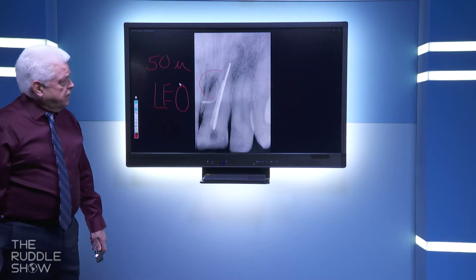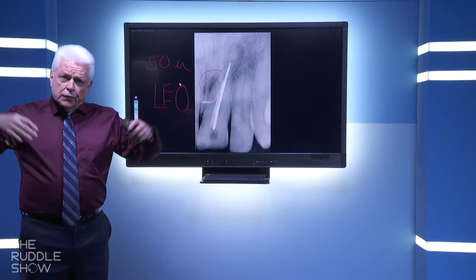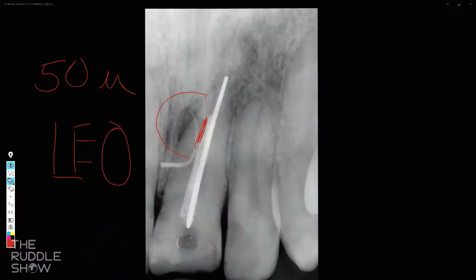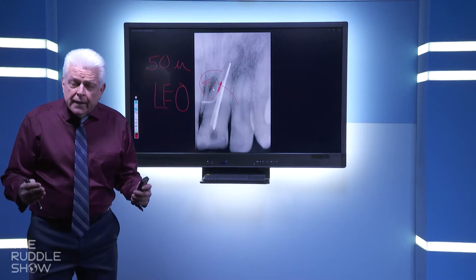And the lesions form adjacent to the portals of exit. So we roadmap this. By roadmapping, we can, in our mind's eye, build a library of cases we've treated over the years, and we would expect a lateral canal. When you're using chemicals, for example, you can get a slurry of gutta-percha, and that can block or occlude the opening to the lateral canal. Now your reagents don't get into the lateral canal, you can't clean it, and you leave stuff in the lateral canal. So when you pack, you can't overcome stuff left behind.